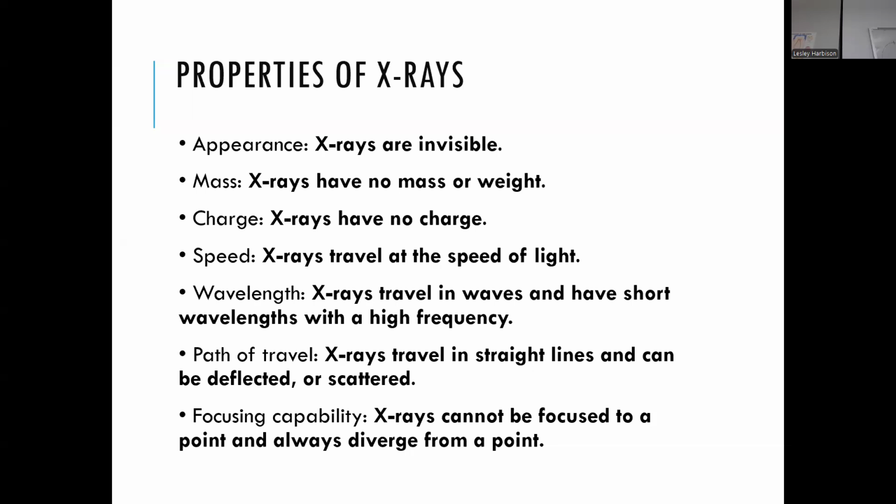So the question might be, trying to think of a specific question. But it'll probably ask something more about the density of material and penetrating power, and then the power of the X-ray photon to get through those different materials. So it's more about absorption, getting through, penetrating. It's a little bit more of a concept as opposed to just memorizing a term. Okay. Properties. So almost the last slide.